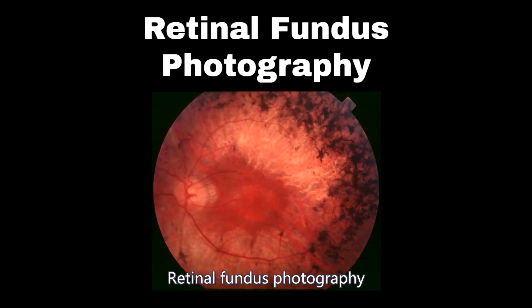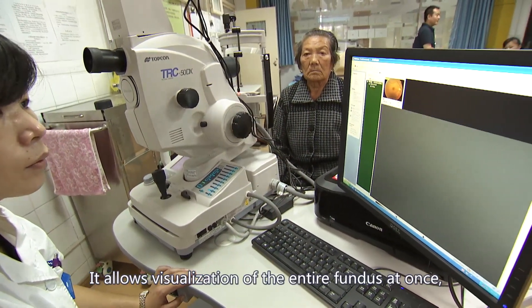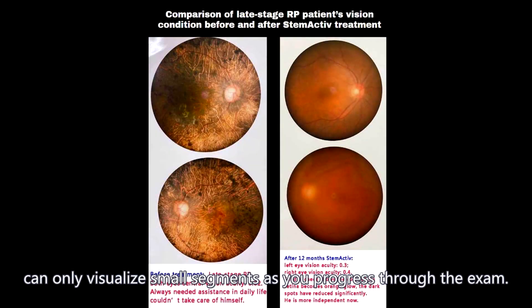Retinal fundus photography will yield a higher clarity of the retina and pick up other defects. It allows visualization of the entire fundus at once, whereas the handheld ophthalmoscope can only visualize small segments as you progress through the exam.